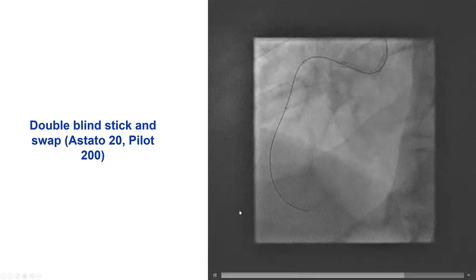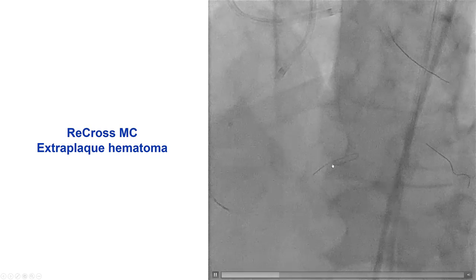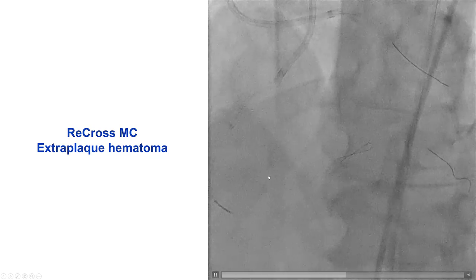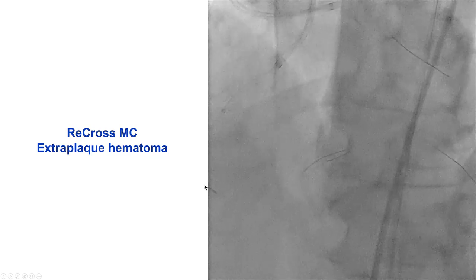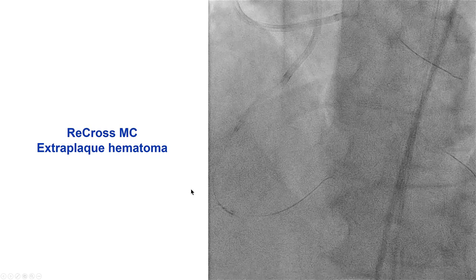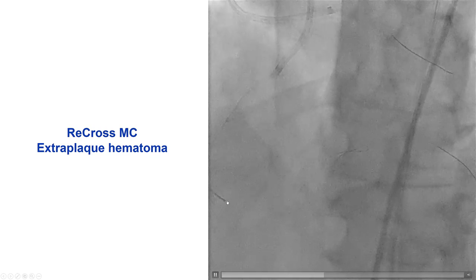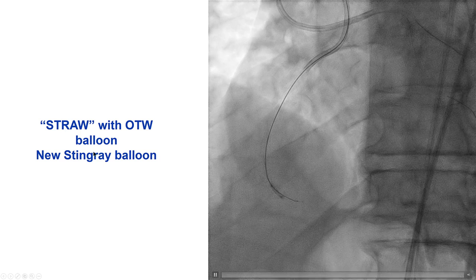We then did re-entry attempts using the double-blind stick-and-swap technique with an Astato 20 and a Pilot 200. Although the wire seemed to go in the right place, it did not. We switched to the Recross dual-lumen microcatheter, applied suction through one lumen, and tried to re-enter through the other lumen. Unfortunately we had the same problem and were aspirating a lot of blood, suggesting a fairly extensive extra-plaque hematoma. We then did the full straw technique, advancing an over-the-wire balloon next to the Stingray balloon, applied suction, and tried re-entry again.